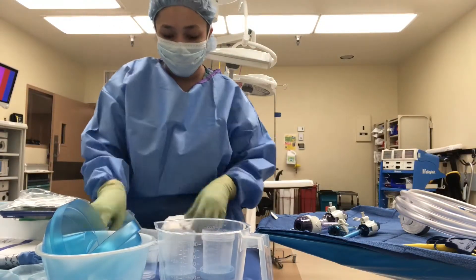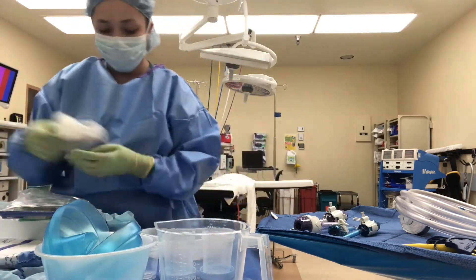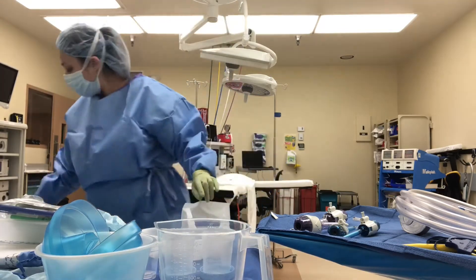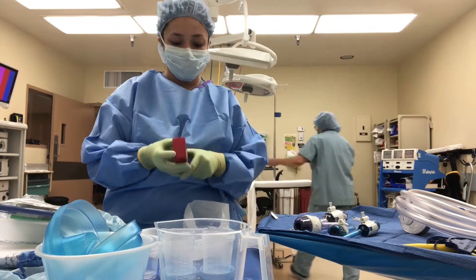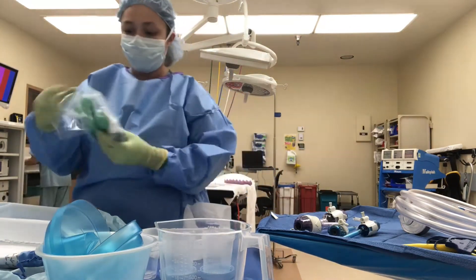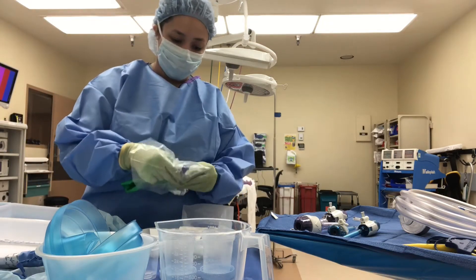Here I'm setting up my medicine cups. For a lap appy you'd usually want everything on the other side unless the doctor has a student with them or an assistant. I was unsure because he usually has students most of the time, so I decided to set everything up on the opposite side of where I would if I was doing it with him alone.